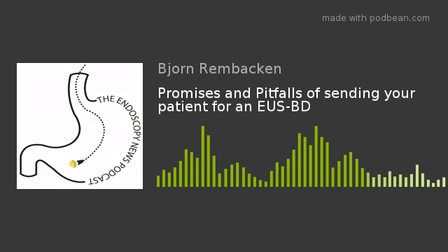And we are very careful not to let our ERCP technique slip and not to use EUS-guided biliary drainage as a crutch for bad ERCP technique. I think that's very important to state. Usually this is going to be in the context of patients, as I said, who have inoperable malignancy, who have an inaccessible papilla either due to duodenal stenosis or indwelling duodenal stents or ampullary infiltration or previous surgery. And those are the best examples of when EUS-guided biliary drainage is appropriate.